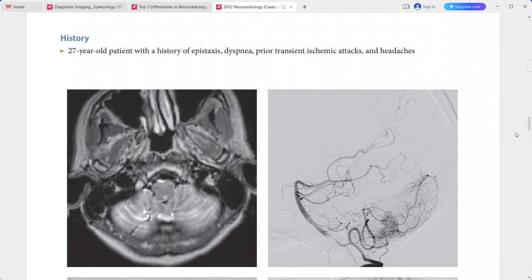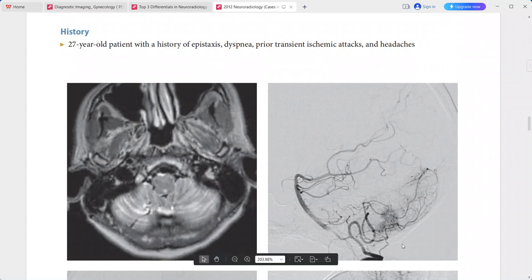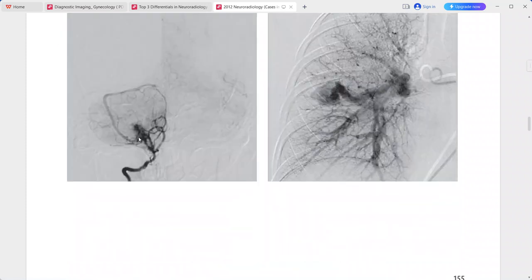Next is a 27-year-old patient with history of epistaxis, dyspnea, prior transient ischemic attacks, and headaches. The T2-weighted axial MRI shows an abnormally prominent vascular flow void coursing within the right cerebellar hemisphere. Catheter angiogram of the vertebral artery shows an abnormal tangle of vessels.